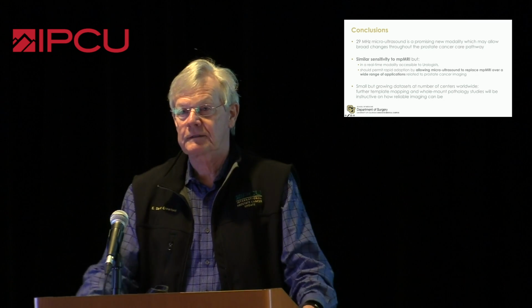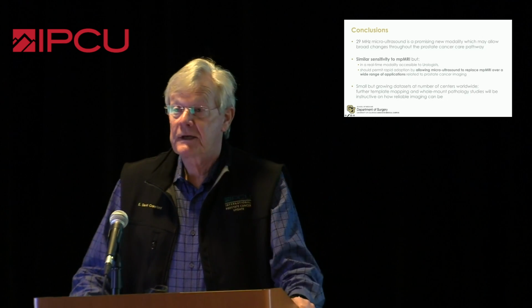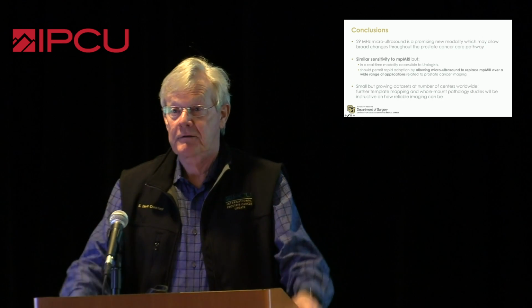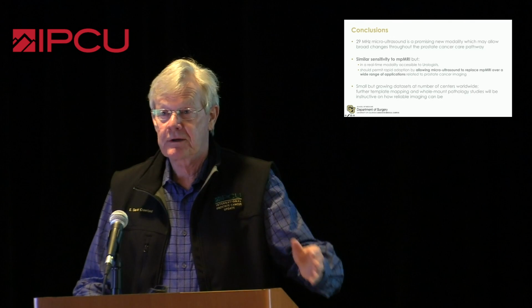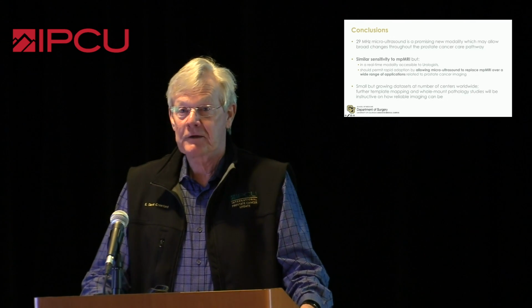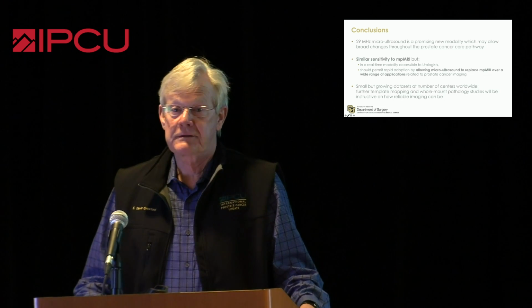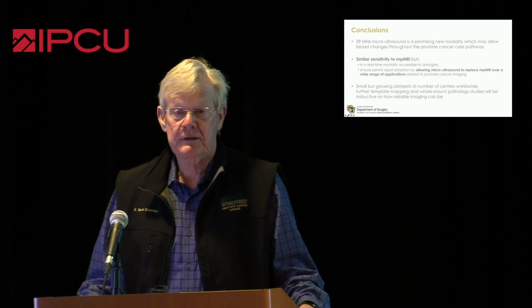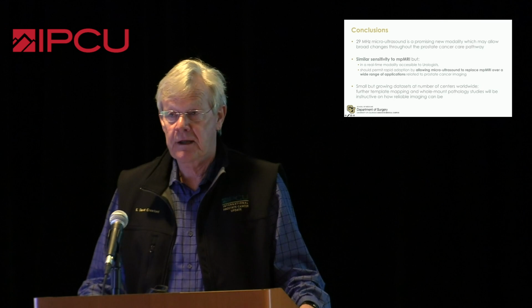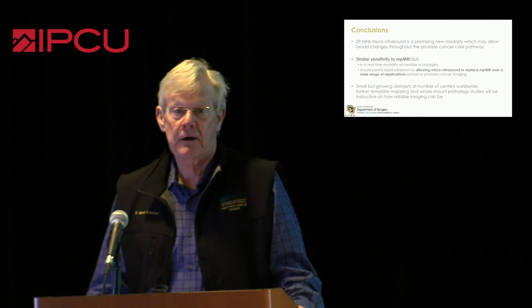I really predict that urologists are going to embrace this. Why? Because, one, I know we have radiologists here, Dr. Bush, who's done more MRIs than anybody in the world, and other people here, and Ryder in the UCLA group. But you know what? I think that this is in the hands of urologists. There's a place for MRI, but you get instantaneous gratification and outcomes here.